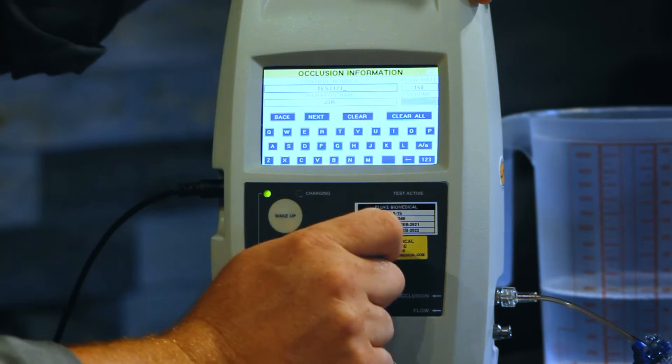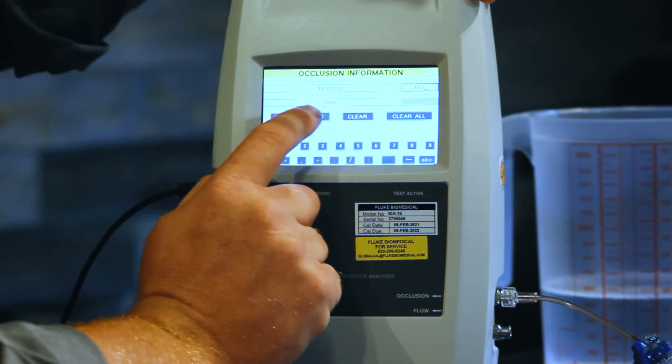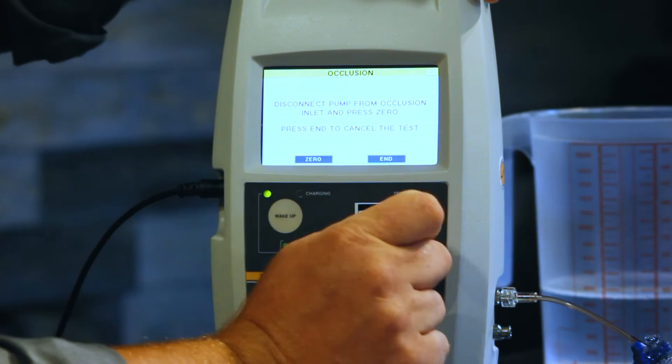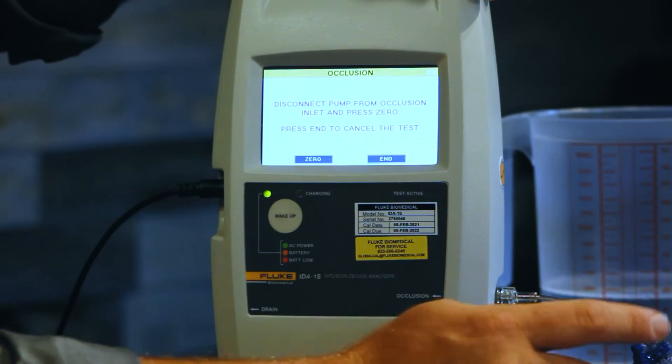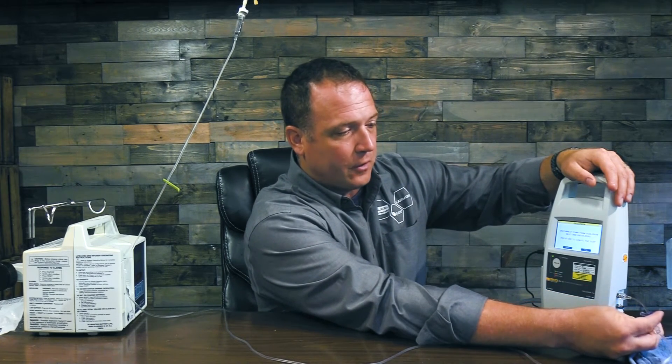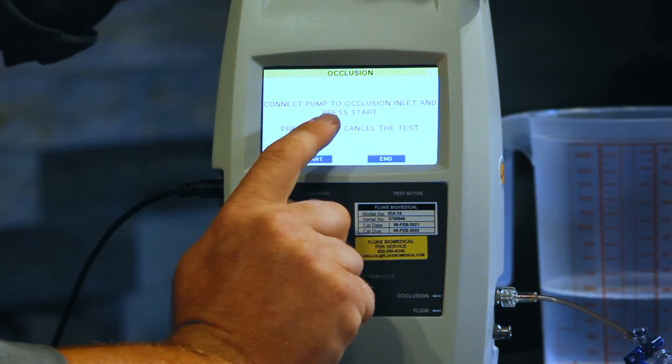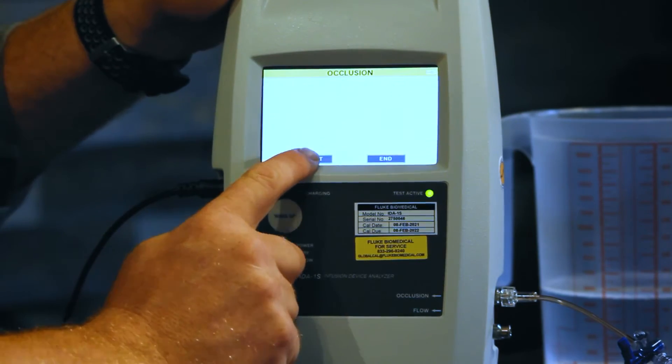We're going to do our occlusion test here. So now on the IDA we're going to go to occlusion and our rate is now going to be 30 — we'll clear that and hit 30. Next. Disconnect pump from occlusion inlet and press zero. So I open up the stopcock from that occlusion pressure port because we need to zero out that pressure transducer — shut off the flow lines, now we're open to air, and hit zero. Connect pump to occlusion inlet and press start. So now I'm going to close that port, press start on the IDA and start on my infusion pump, and it's going to start to build pressure.